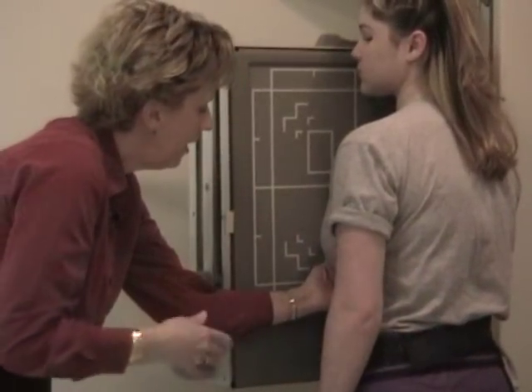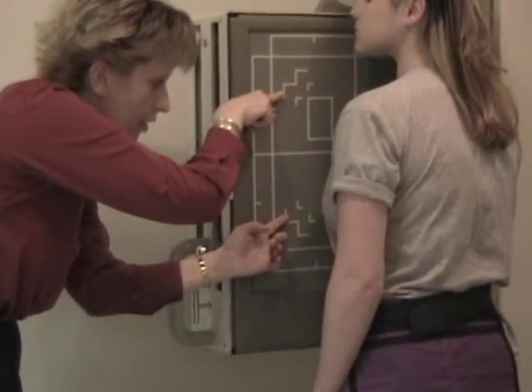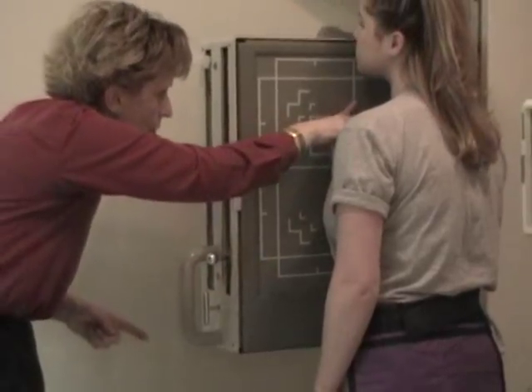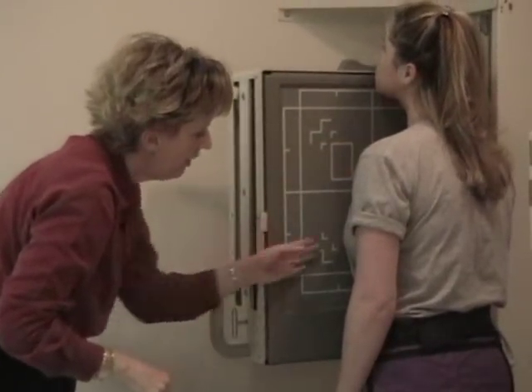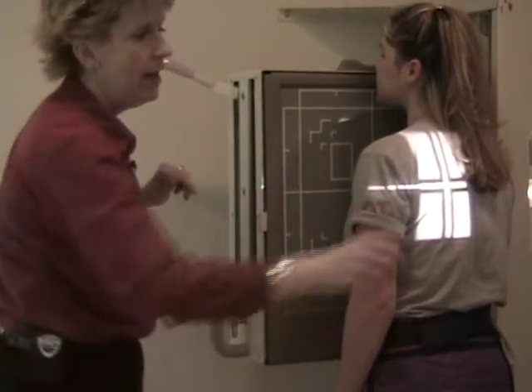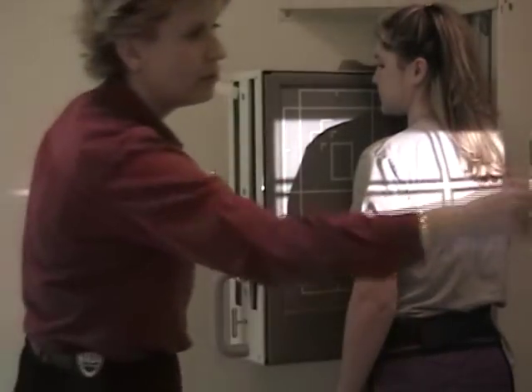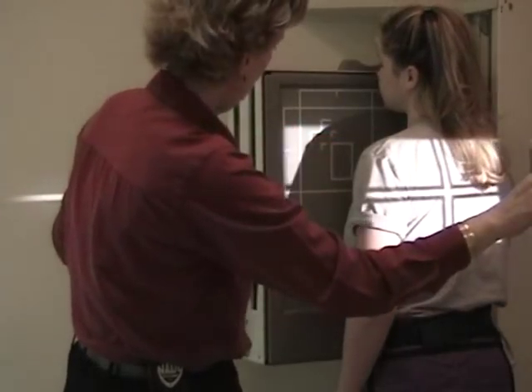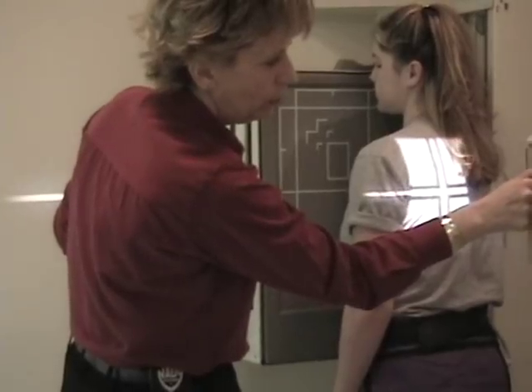If you can find the xiphoid process and the manubrial notch, you want to center the sternum to the film. So I'm happy with the film's edge being 2 inches above the manubrial notch. I found the xiphoid, and I'm very satisfied with the centering of the board, and then I fix my tube to match my film and readjust the collimation to approximately 8 by 12 inches.